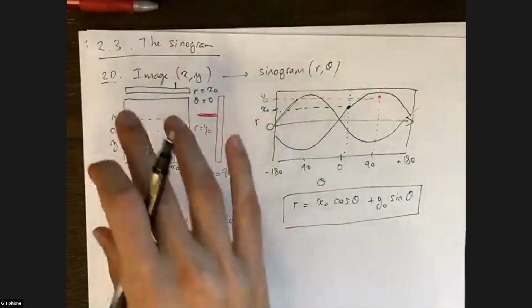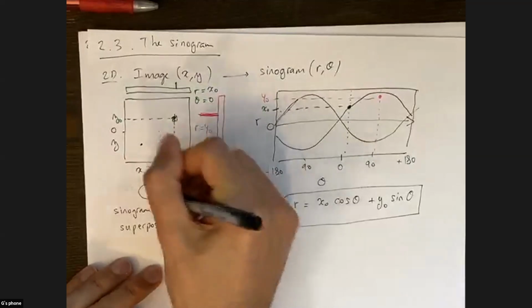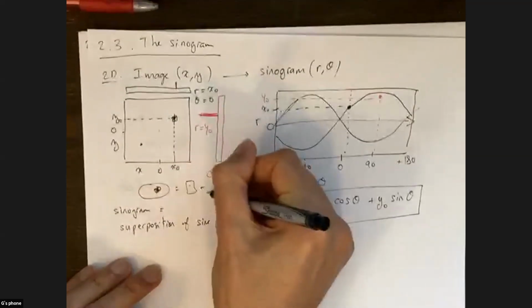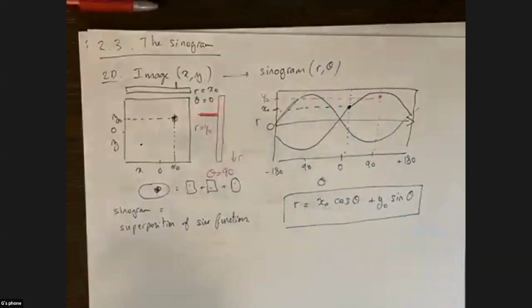If you have a distribution, like this is your image maybe, you can write that as a sum of this plus this. And because it's a linear system, this is also an important part, those imaging systems are linear. So if you add up two different tracer distributions, the output is just the sum of the outputs for the individual inputs.